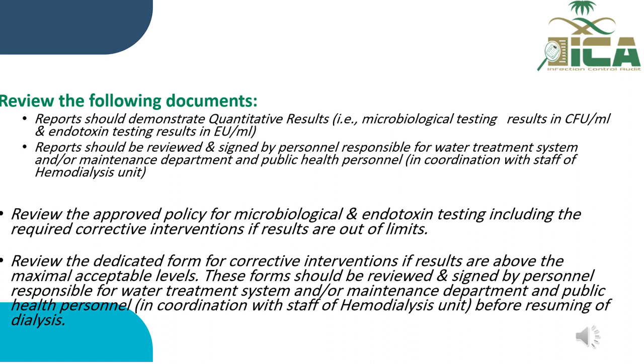Review the approved policy for microbiological and endotoxin testing, including the required corrective interventions if results are out of limits. Review the dedicated form for corrective interventions if results are above the maximum acceptable levels. This form should be reviewed and signed by personnel responsible for water treatment systems and maintenance department and public health personnel.